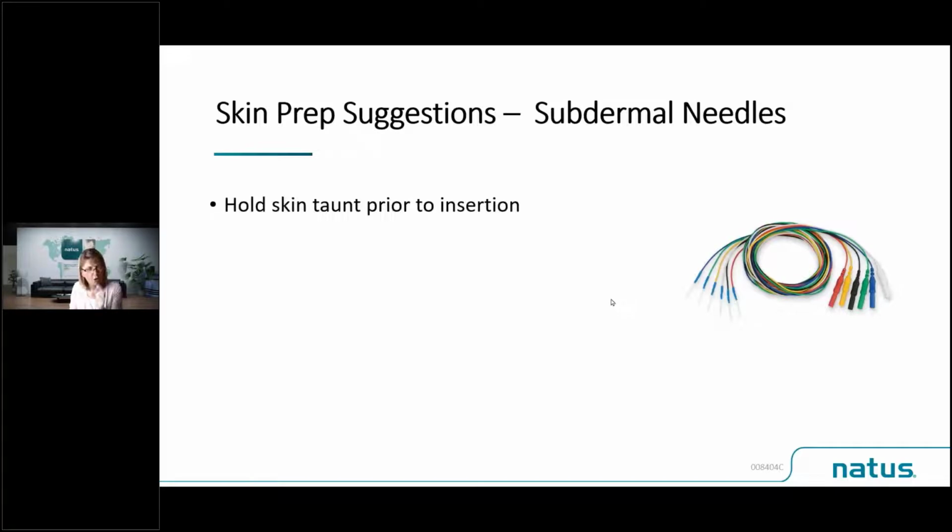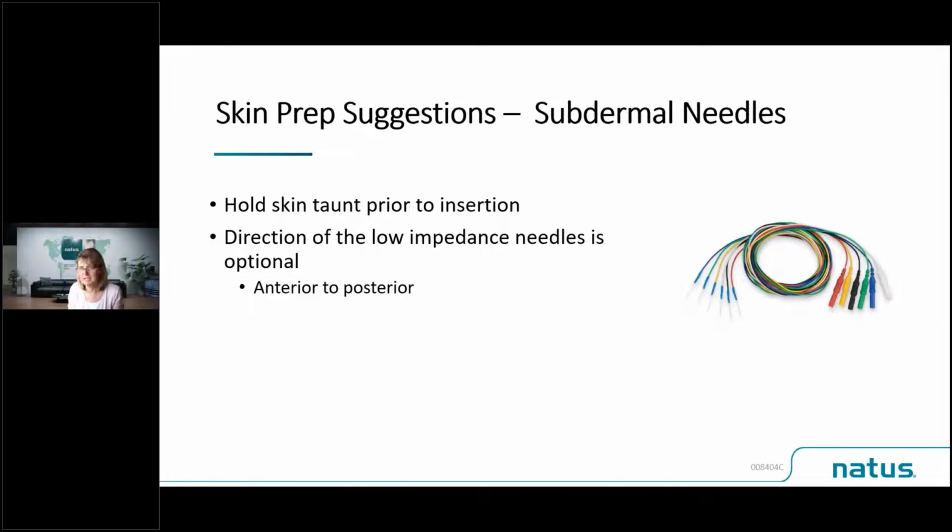So like I said, hold that skin taut prior to insertion. Important to remember, the direction of the needles is optional. It's not mandatory which way you put them. You can put them anterior to posterior, posterior to anterior.